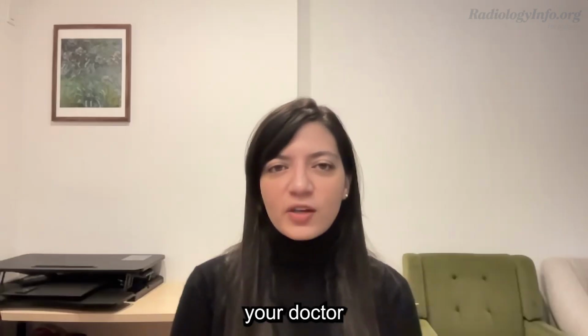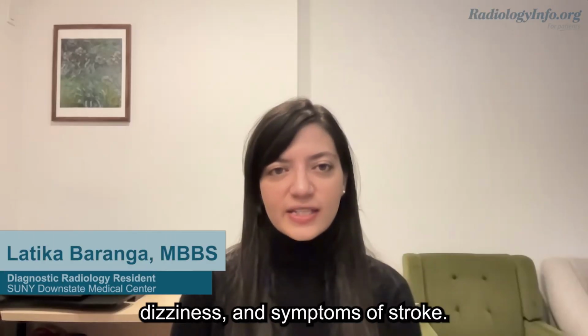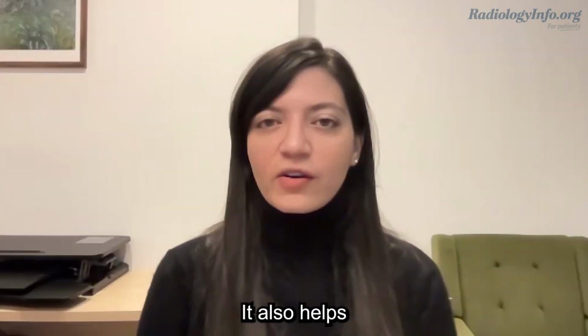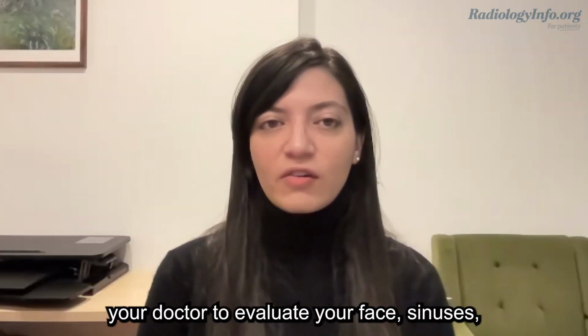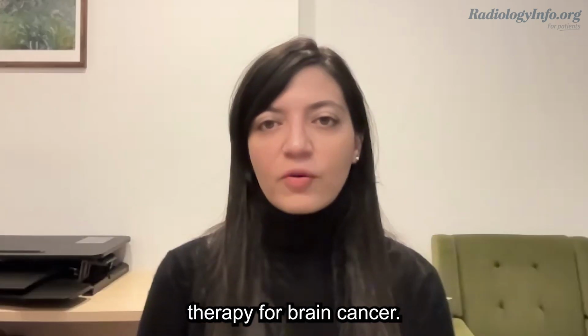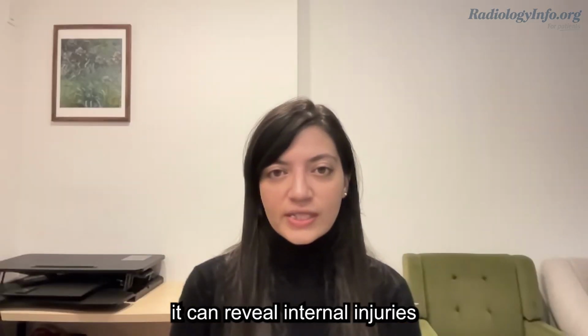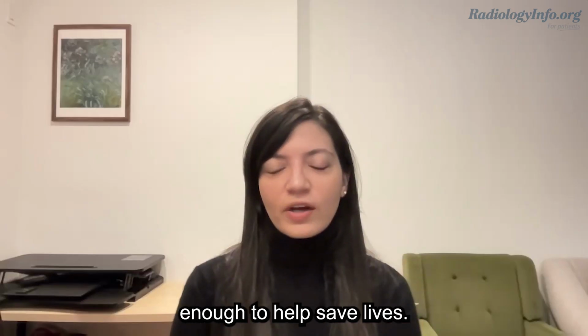Head CT helps your doctor assess head injuries, evaluate for severe headaches, dizziness, and symptoms of stroke. It also helps your doctor to evaluate your face, sinuses, and skull, or to plan radiation therapy for brain cancer. In emergency cases, it can reveal internal injuries and bleeding quickly enough to help save lives.